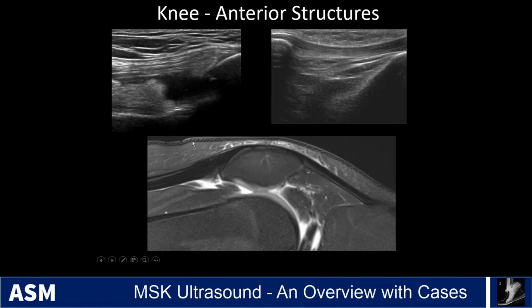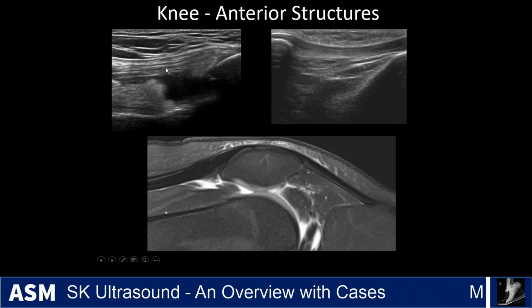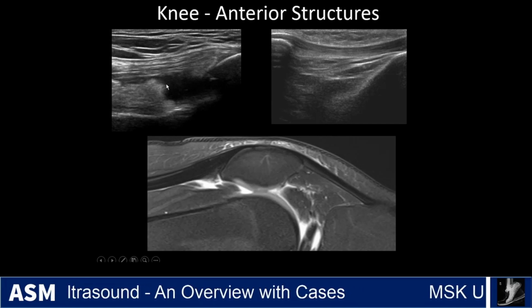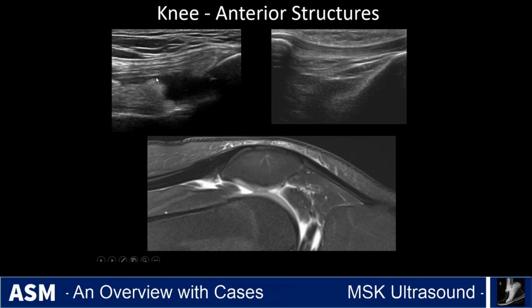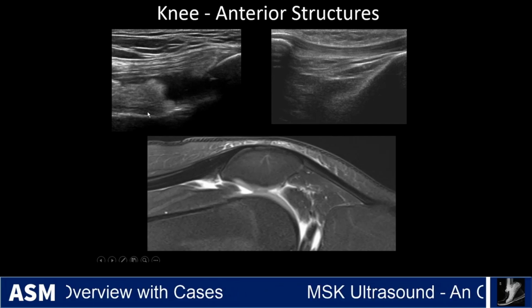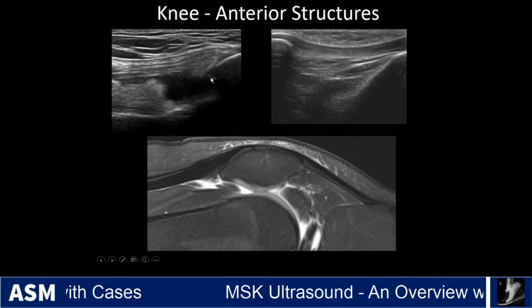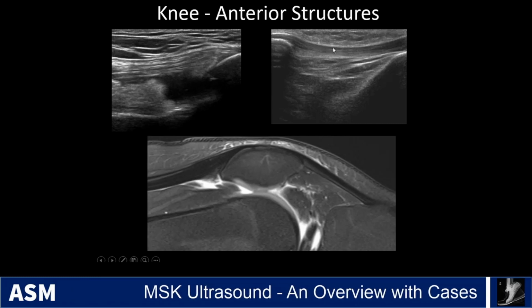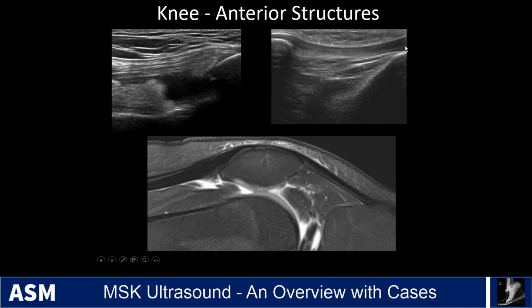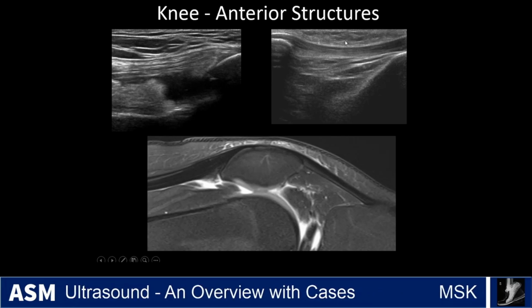the prefemoral fat pad here. The corresponding ultrasound showing in long axis the quadriceps right here, overlying subcutaneous adipose tissue, the prefemoral fat pad right here with the femur down here, suprapatellar bursa, and the quadriceps or suprapatellar fat pad here. As we slide further down, here's the patella, and you see the patellar tendon coming down with that normal fibrillar pattern toward the tibial tubercle with Hoffa's fat pad deep to it, subcutaneous tissues on top.